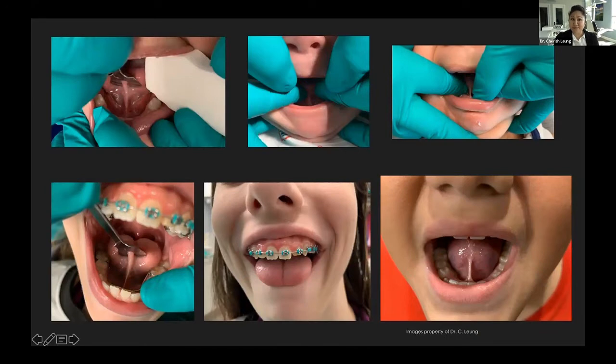Another one, you can see this one visibly, super thick, especially for a tiny baby. A lot of breastfeeding issues, a lot of spitting up issues. And this is one of the girls I said who survived a long time with that tongue tie. Super anterior tie. This is her actually sticking her tongue all the way out. She wasn't able to extend it and it curled all the way under. And you can see here, again, super thick. She actually had this revised twice in her lifetime by an ENT. And unfortunately, whatever happened, she still has that tie. So we need to treat that one.